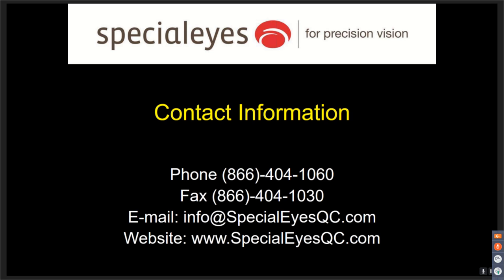The specialized group knows that I had a lovely patient who passed away last year who was in her 90s wearing these multifocal or bifocal lenses. As your patient ages, you can alter things in these lenses and you can keep them in these lenses for really ever. And since the lens doesn't dehydrate, it's a very wettable lens, and it stays on the eye very well as far as dehydration. So that isn't an issue. Patients are able to wear this lens for long periods of time and for years.